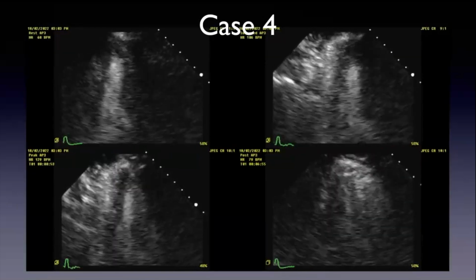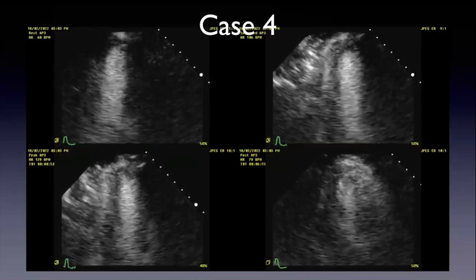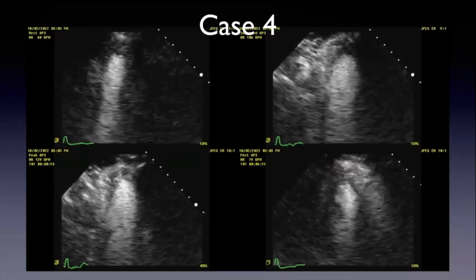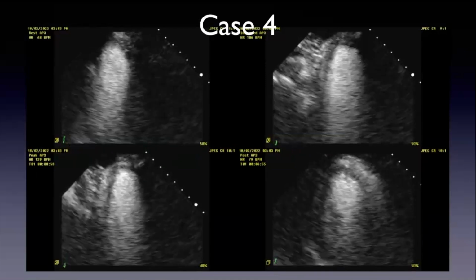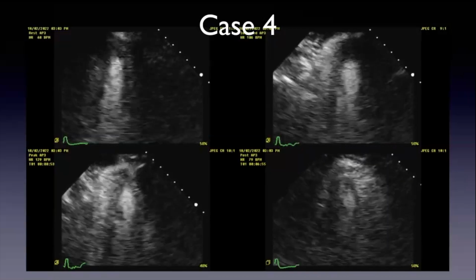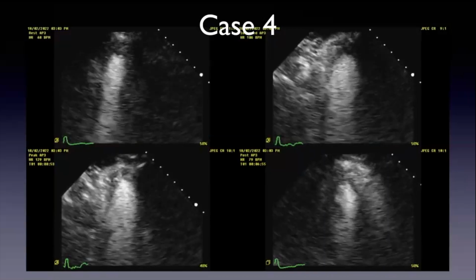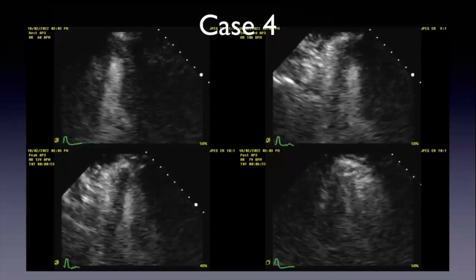Here's the 3-chamber view. You don't see it at all in the 3-chamber view, right? A little bit in the peak, maybe. Actually, this is from 2022. I can tell you the sonographer didn't see anything, and the fellow who pre-read the study didn't see anything. But it's a very subtle abnormality, right? And it was kind of a low pretest problem. It's probably coming in and out.